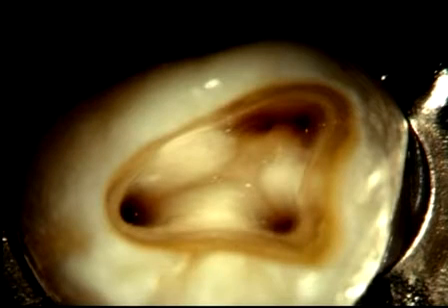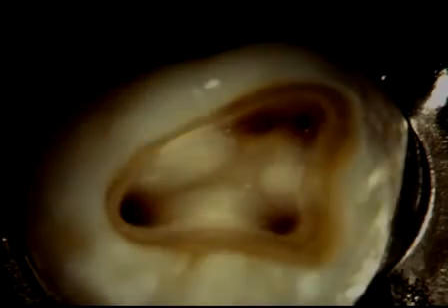Access cavities should be cut so the pulpal roof, including all overlying dentin, is removed. The size of the access cavity is dictated by the position of the orifices. The axial walls are extended laterally, such that the orifices are just within this outline pattern. Access objectives are confirmed when all the orifices can be visualized without moving the mouth mirror.